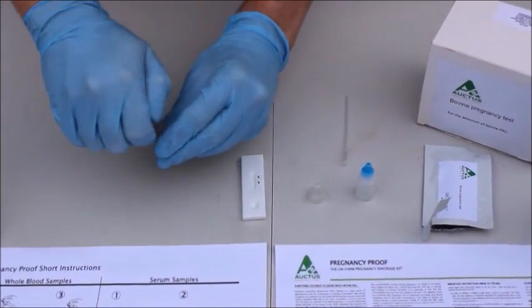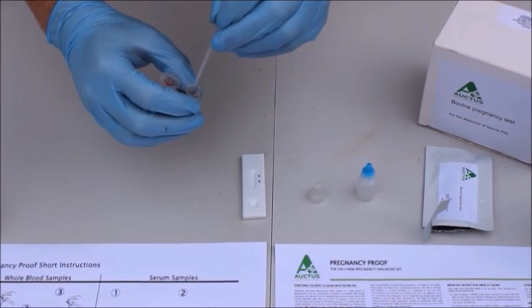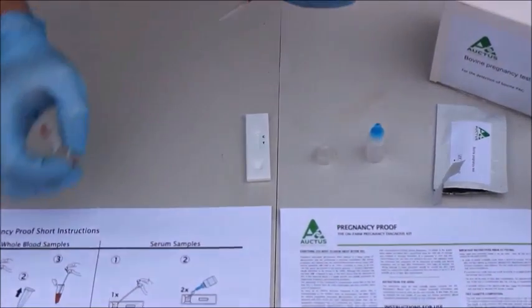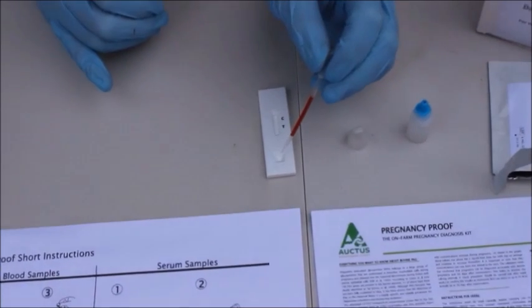Once this is done, we simply take the pipette and squeeze it initially to take up the solution, and then we want to add three drops of the solution into the well of the test cassette.